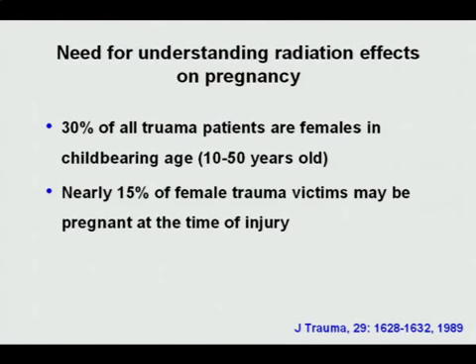Like most of you know, that's where we get the calls from the emergency room, where they have already done the imaging to save the patient, where the benefits far outweigh the risk. At that time, we are retrospectively asked to calculate the fetal dose. And that's what this particular talk is focused on: how we can assess these things with some of the information we already have.